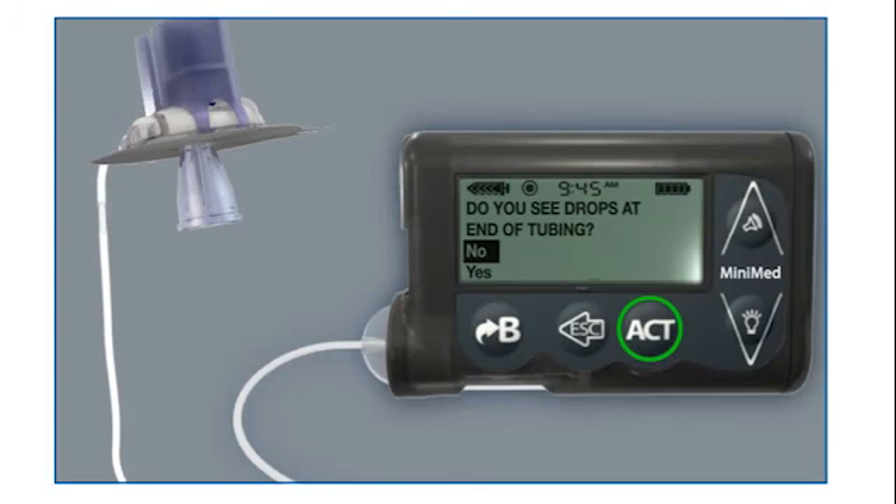A screen displays: Do you see drops at end of tubing? Hold the tubing up to the light to check for air in the tubing. If there is no air in the tubing, select YES and then press ACT. The fill cannula screen then displays.